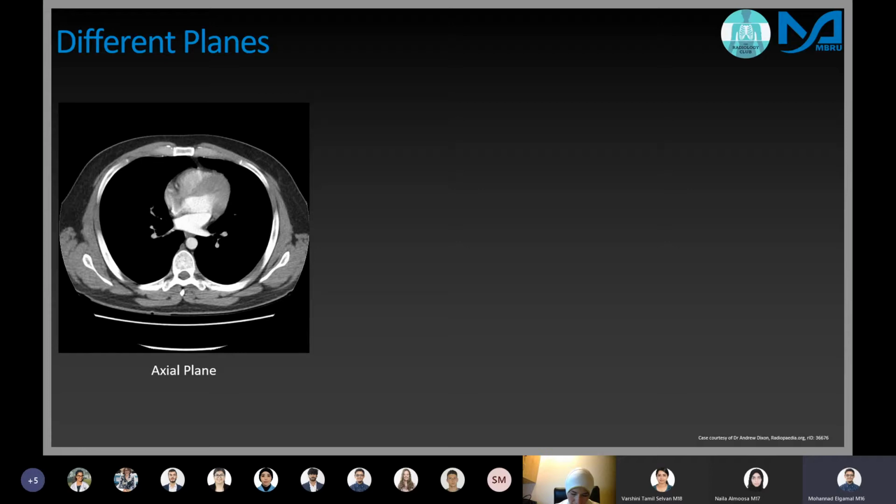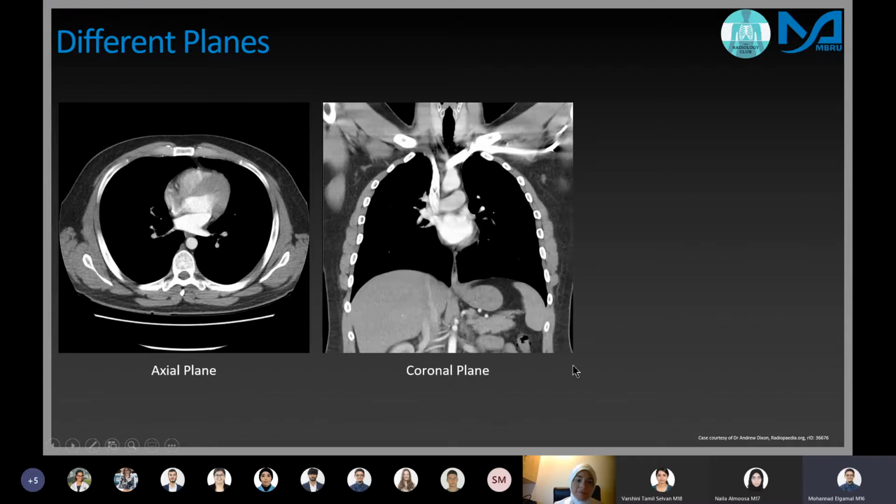And it's usually the most common CTs I've personally seen. You would look at them all the time, but you can also have different planes to help you locate something. Another example of that plane would be a coronal plane. A coronal plane is just cutting through a person sort of from front to back. And you can see the sides of the patient and the top and the bottom, so the superior and inferior of the patient, but you can't really see the front and the back. You could only see the other directions.